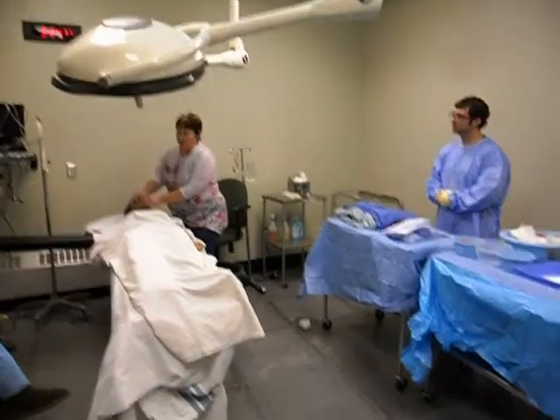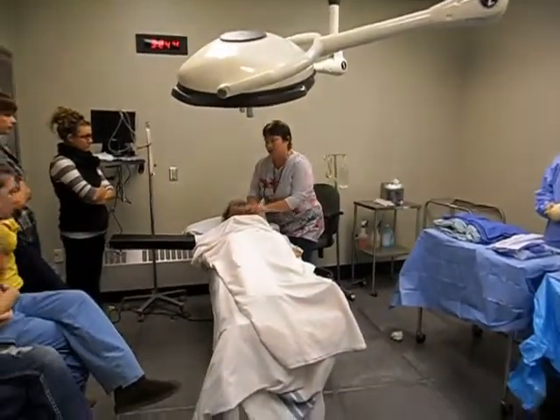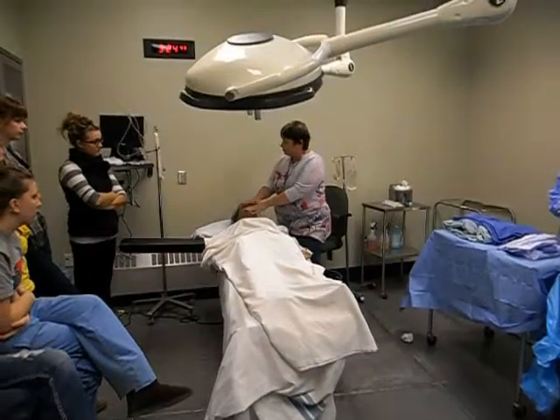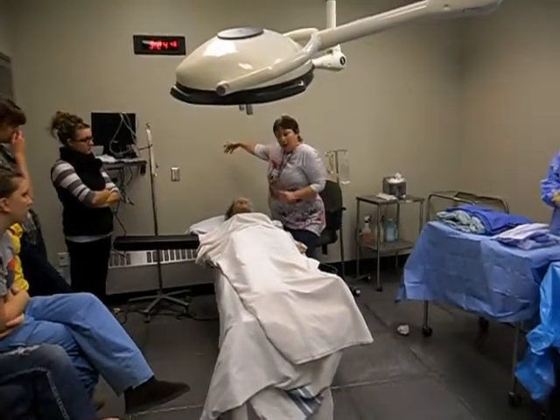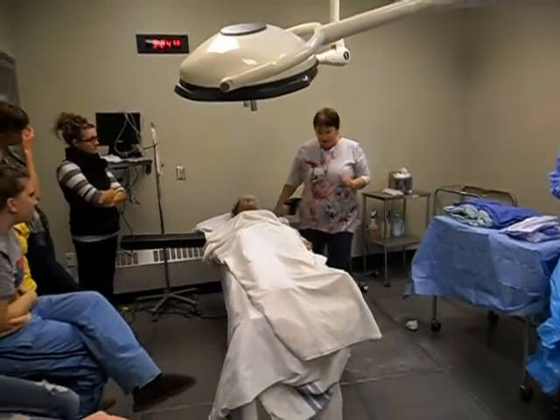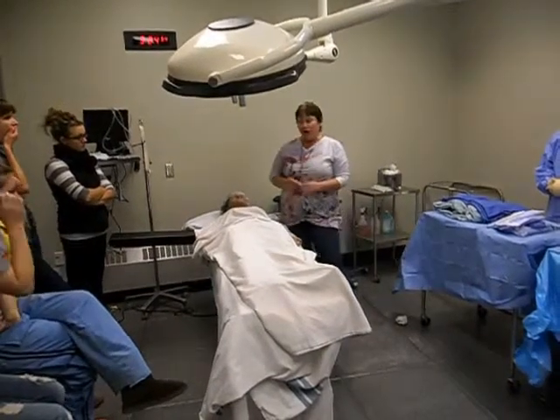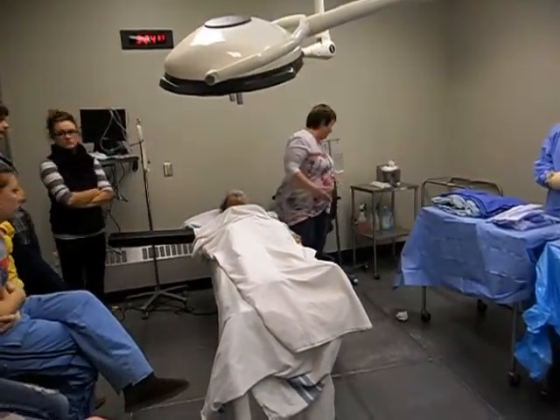Then I'm gonna tape it down, and you as the anesthesiologist are gonna listen to her lungs to make sure the tube is in the right spot. Now I'm gonna turn on my inhalation agent and gas, right? And she's asleep, and your RN would have made sure that your RN is here in the building before we would have done any of that.